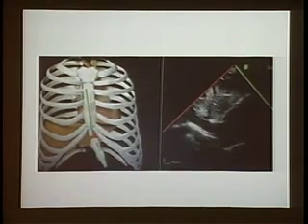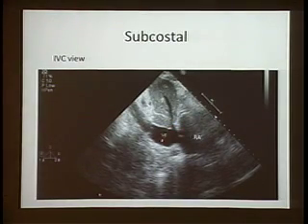And you can see the marker here. And this is what you should see. Most of the measurements we do at the IVC should be done like a centimeter, centimeter and a half from the RA. You have to make sure that this is the RA. The aorta is just behind this, and sometimes can be easily confused. And that's why one of the things that they ask is please be sure that when you're looking at this vessel, it enters the right atrium, because it can be easily confused. And I'll show you an image with the aorta as well.